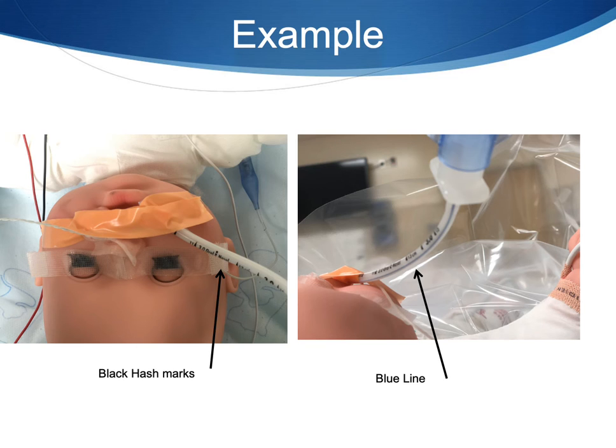So why is this important to me? Well, the next slide is going to show you in a pediatric population, we kind of share the airway with the surgeon. The drape's on top of it. We're talking a small baby. The arms are maybe on top of our endotracheal tube. We got everything in our way. So the next picture is going to show you why this is important and how my precordial stethoscope, we'll discuss shortly, can help me figure out which direction my endotracheal tube may be.